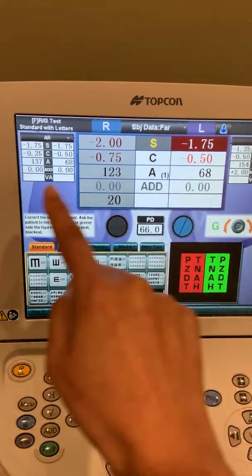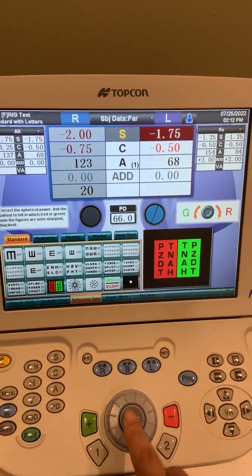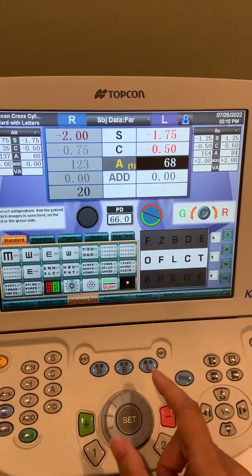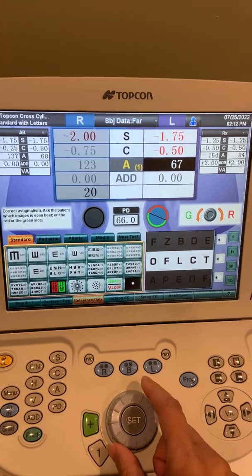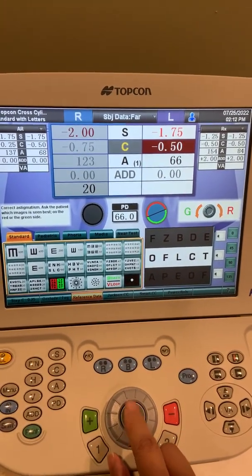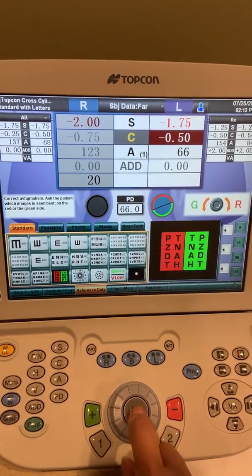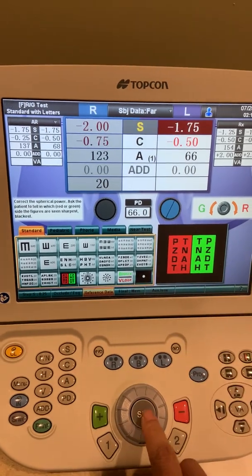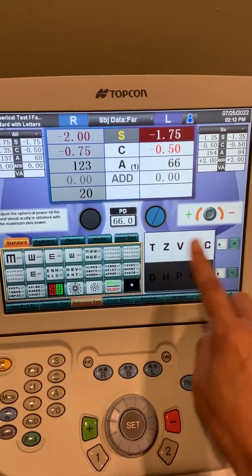Same idea — instructions are here and the screen is here. If they say equal, you just press this button. If they say red or green, go ahead and go in that direction, and then hit set if it's equal. Same thing for the cylinder power, then hit set. It will check again the spherical power, and then don't forget to press the visual acuity.